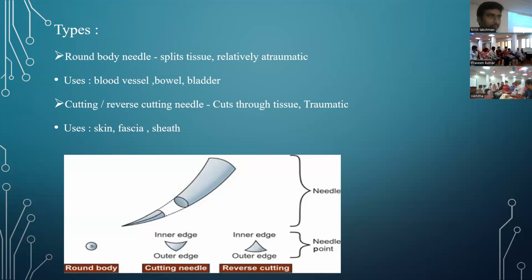And also, I have not seen it here, but for abdominal closure, the needles used to come blunt, because they thought there was less risk of injury to you or your assistant. But I haven't seen it here. It is very difficult to drive them through the patient's tissues. You need a sharp one. Go on.